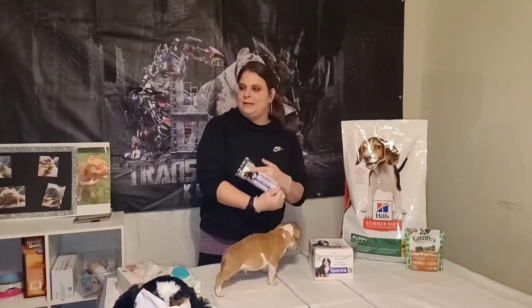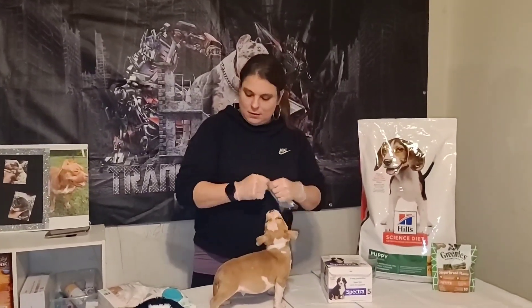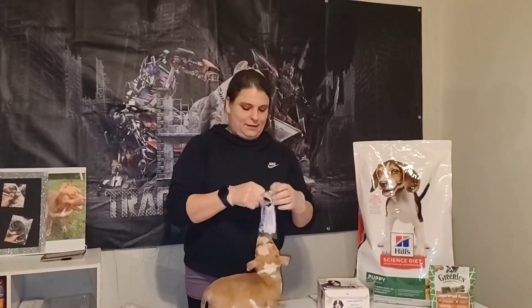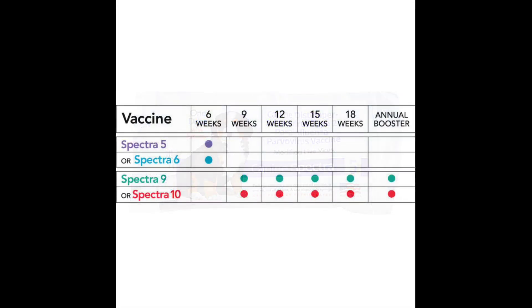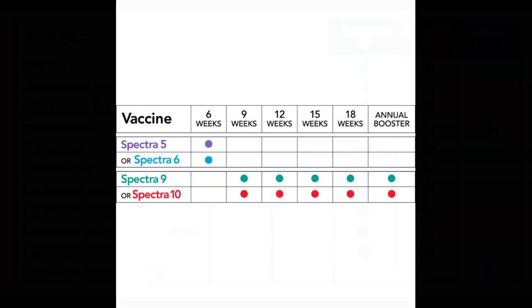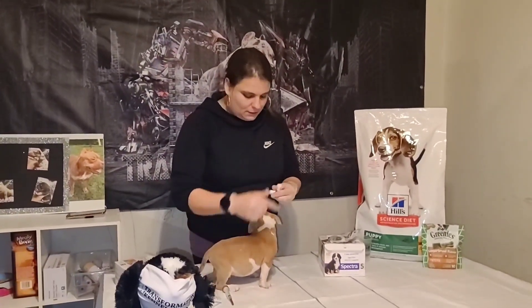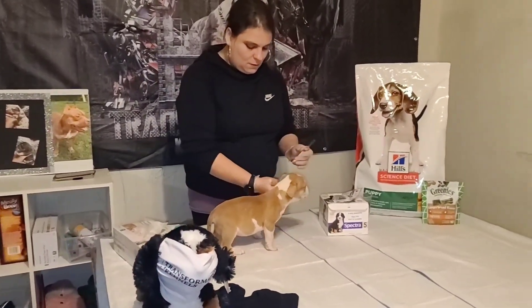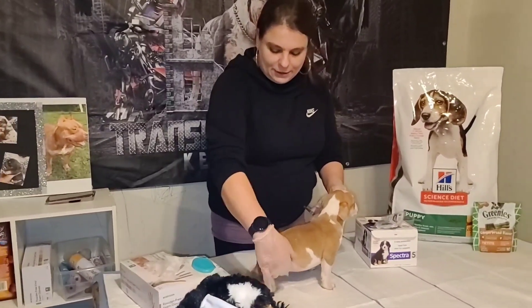We're going to do the Spectra 5 — that's another one for six-week puppies. They can get the five or the six; we got the five. I'm going to show you how to self-administer. On little puppies at six weeks, they have three injection sites you can choose from.